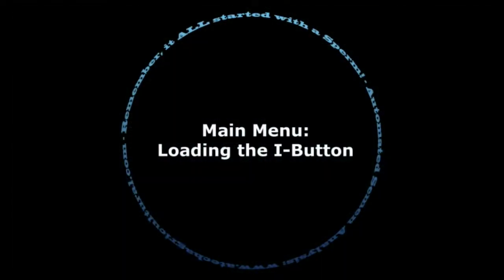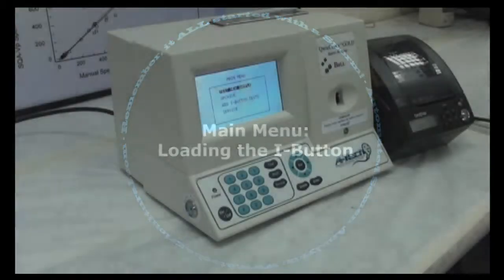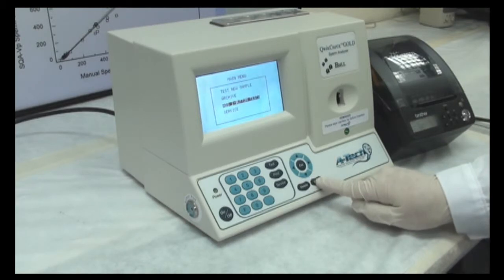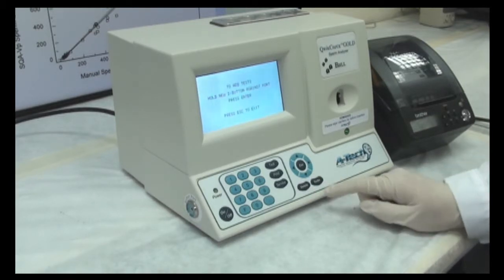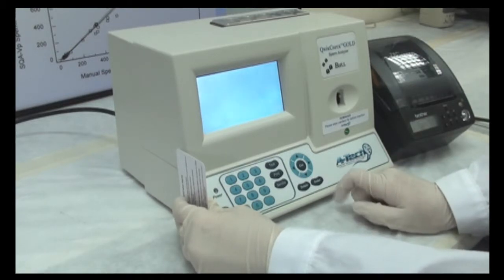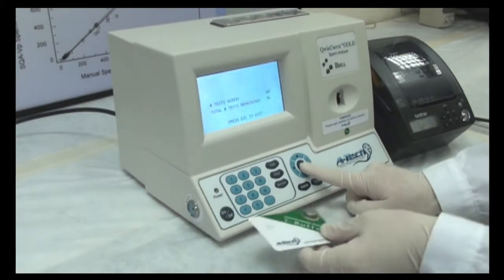When you purchase a QwikCheck Gold test kit, you will receive an iButton test card which needs to be scanned into the analyzer. Scroll down to Load iButton Tests and hit Enter. The screen will prompt you to hold the iButton card against the iButton port and hit the Enter key. Simple as that. Your tests are now loaded into the system and you are ready for action.